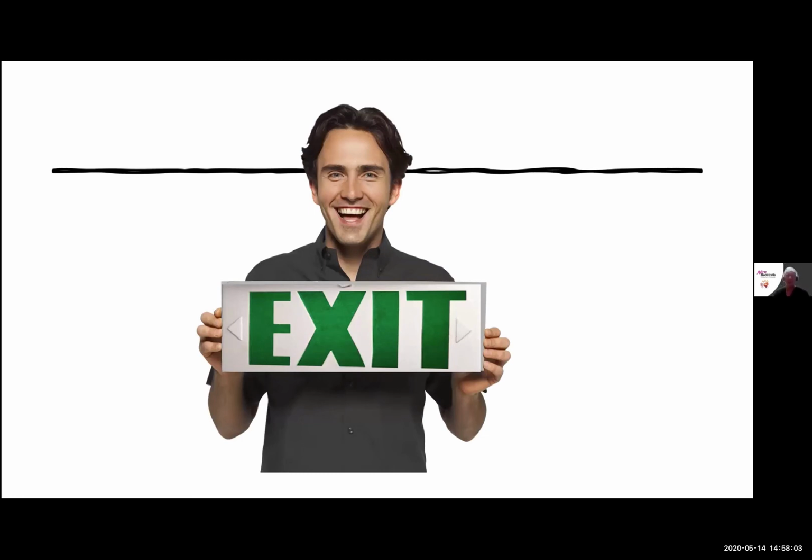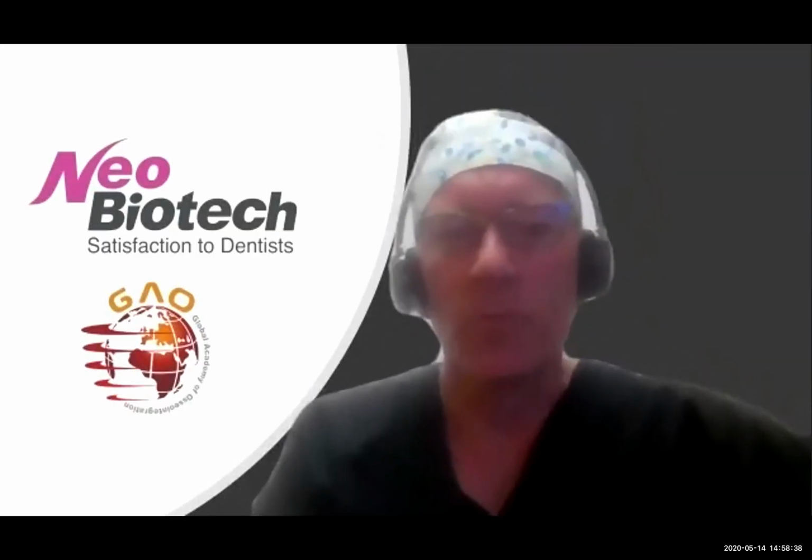There's more to that. This technique is one that I will typically teach in a hands-on setting where we go through a pig jaw. It's a good opportunity to use a pig jaw to practice on, making sure that you're getting the extent of the membrane underneath the periosteum, and that you're creating a tunnel with that. And so I will stop sharing slides, and at this point we'll open it up for questions and answers. Let me open up some of the Q&A as well as the chats too.